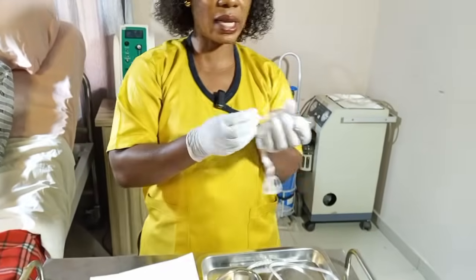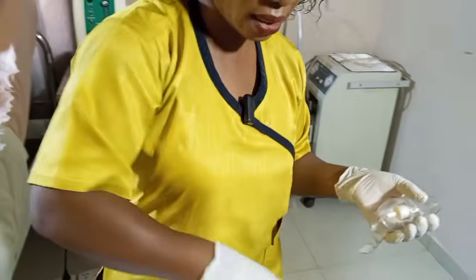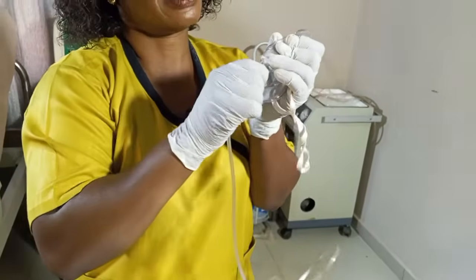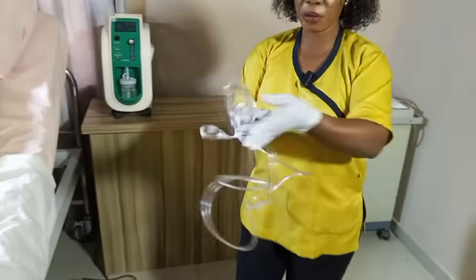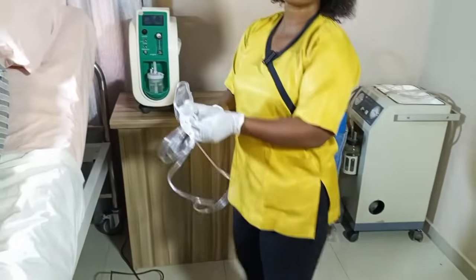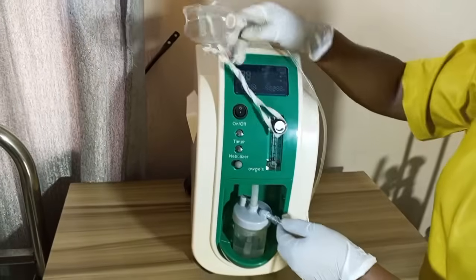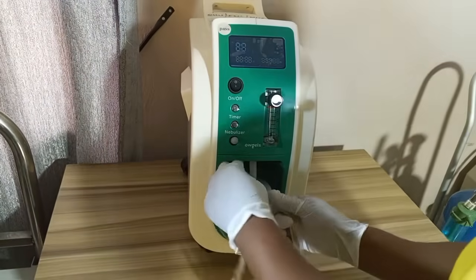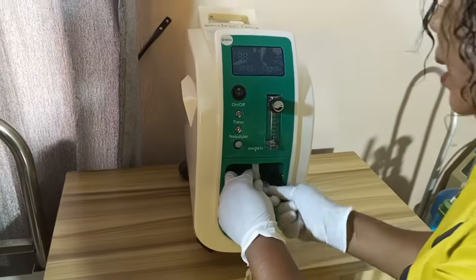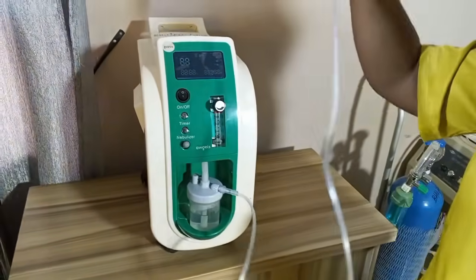The next thing is to prepare my face mask to administer. I connect the oxygen face mask to the tubing. Then I make sure that the oxygen concentrator is functional. I connect my tubing to the humidifier — to the oxygen outlet that is connected to the humidifier. Now I've connected my tubing.